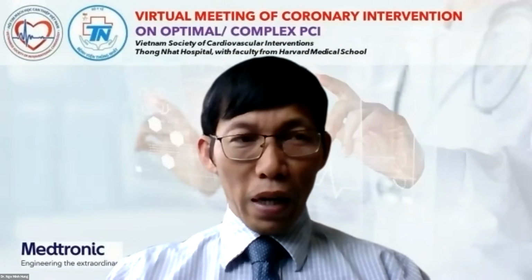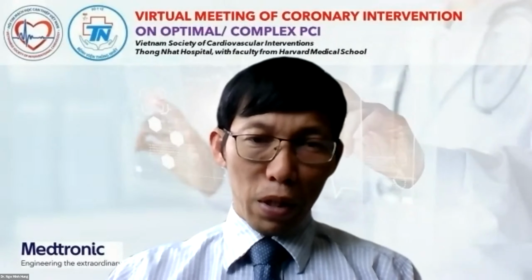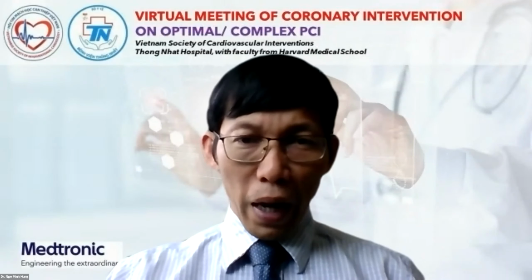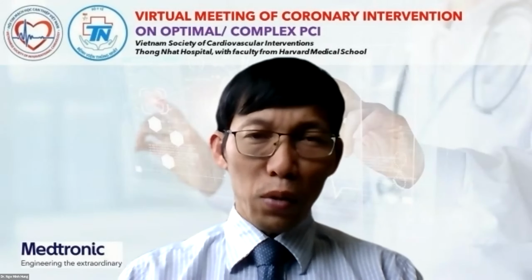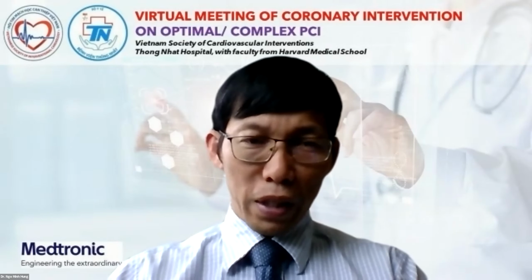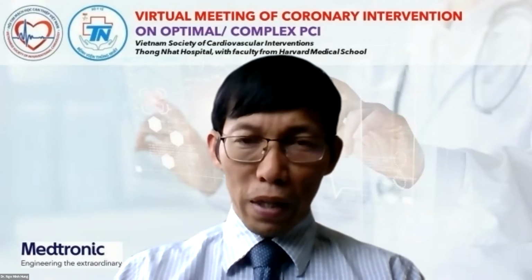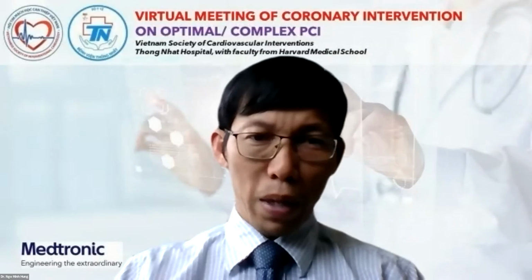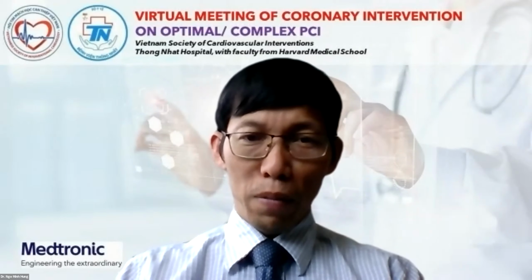Anyway, if I had the OCT, I would use it to evaluate the TCFA for the patient, because nowadays a lot of patients come to the cath lab under 40 years of age, and with IVUS we usually cannot see the TCFA. It's not easy to evaluate the TCFA in that kind of patient. So I want to have that kind of weapon to evaluate the very vulnerable plaque in order to do something more for the patient. That's my opinion about the OCT. I learned the OCT more than 10 years ago in Asan Medical Center, but so far I don't have the machine in the cath lab. Thank you so much for asking me that question.